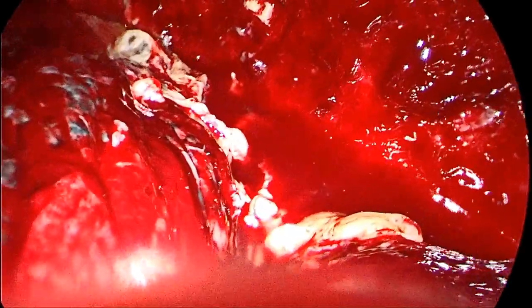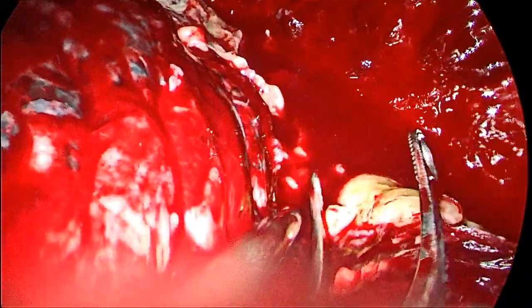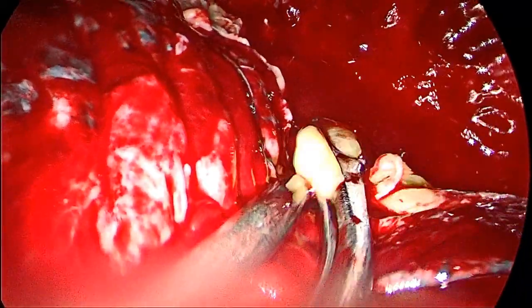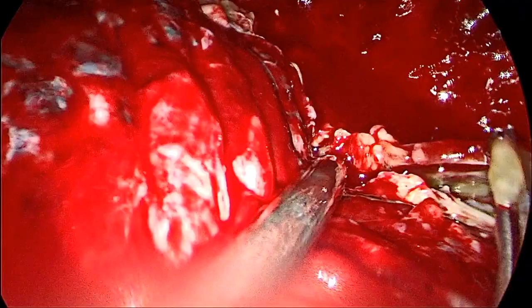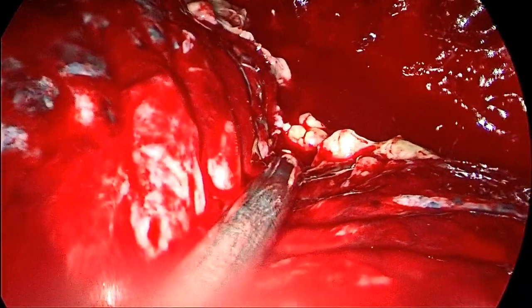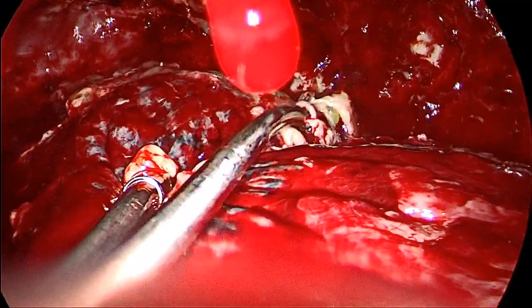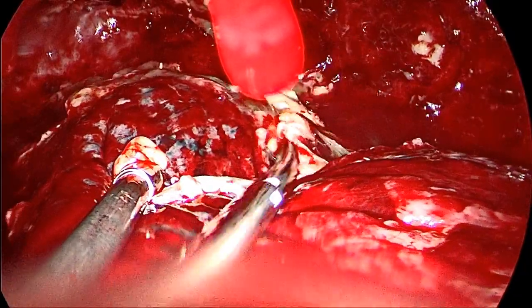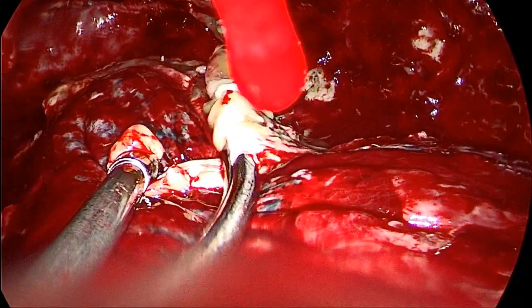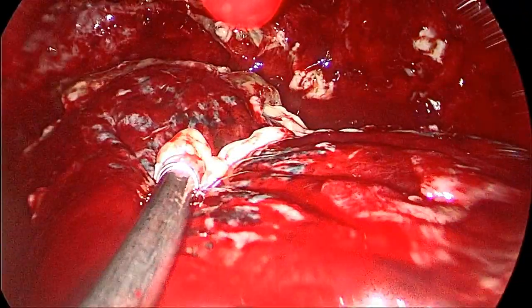As you can see, the largest pouch is at the diaphragm in a sub-pulmonary location, and then the locules continue until the apex of the lung.